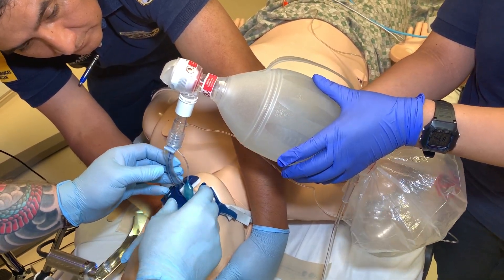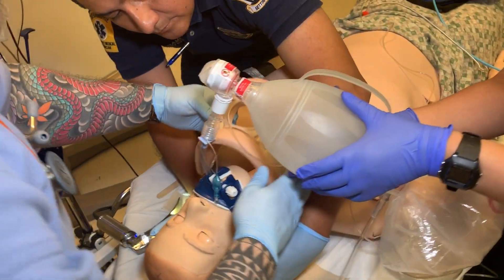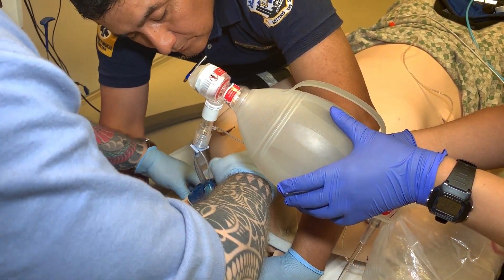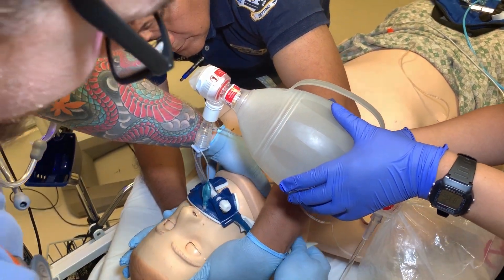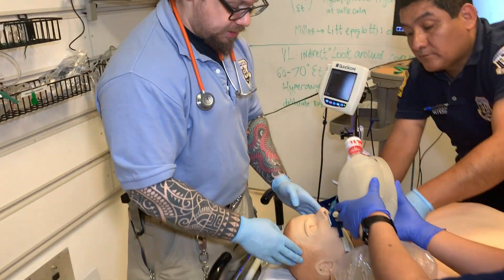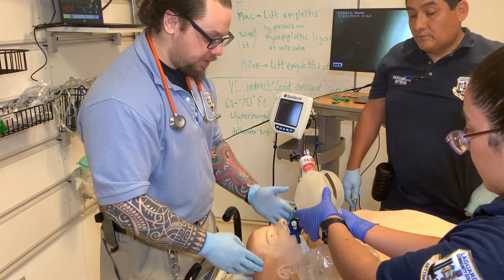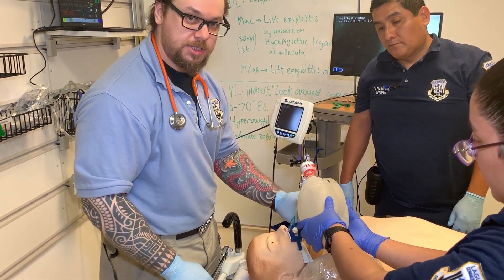I reconfirm end-tidal CO2 and lung sounds. I take the front piece of the cervical collar and realign and secure it. Throughout the entire procedure my partner was maintaining C-spine control in case this patient did have any type of trauma. This is how you intubate somebody who has a potential cervical spine injury without further compromising it.